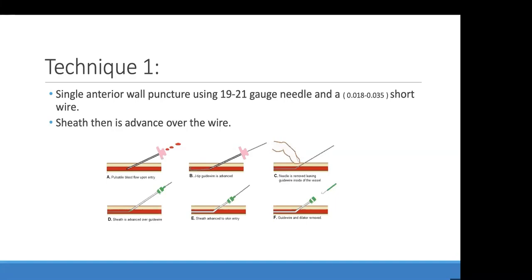When you have a difficult radial, with a small pulse, there is a method that you can use to augment the pulse. You can occlude distally, and that theoretically will engorge the puncture site, which is probably more proximal. So you occlude distally, and that makes the pulse stronger, making it easier for you to fish for that radial.